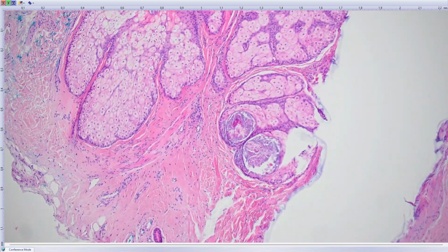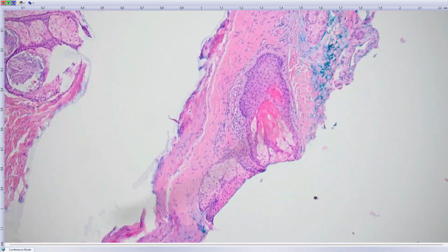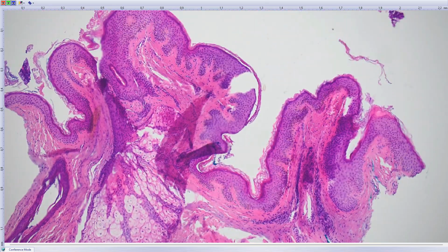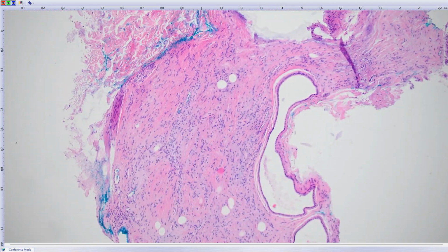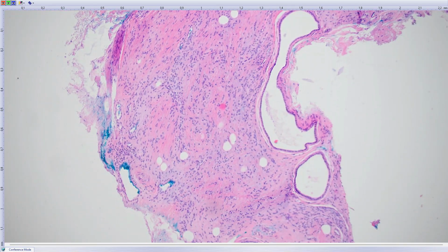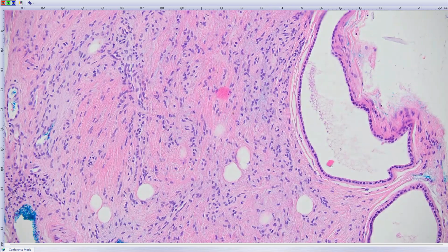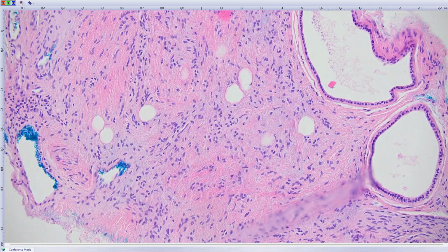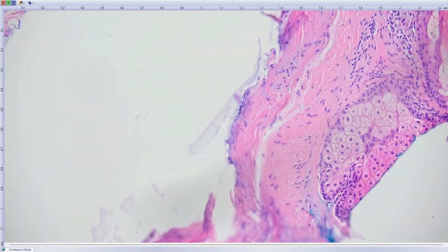So that you would say that it might be a case of so-called trichodiscoma, but if you look into the stroma, you find here this proliferation, which has morphology indistinguishable from spindle cell lipoma. I saw even some lipoblasts in it.